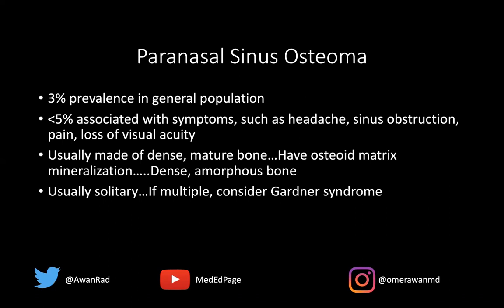These are usually solitary — you typically only have one. But if you start to see multiple osteomas, you want to start thinking of Gardner syndrome, which is associated with intestinal polyposis. Multiple colorectal polyps as well as multiple osteomas — you want to think of Gardner syndrome.